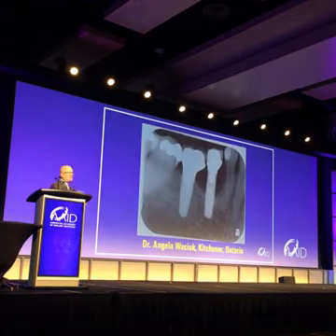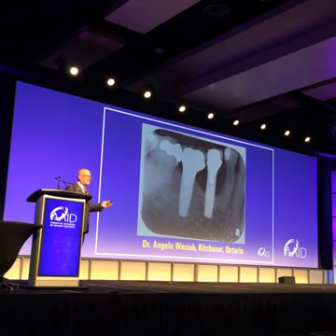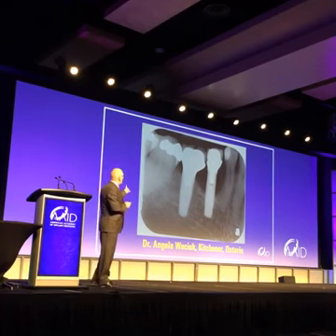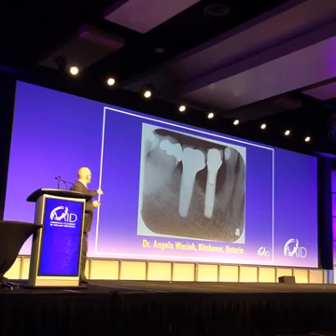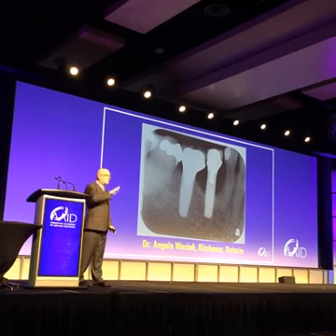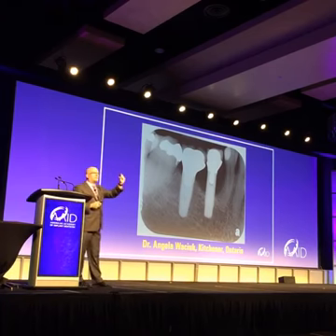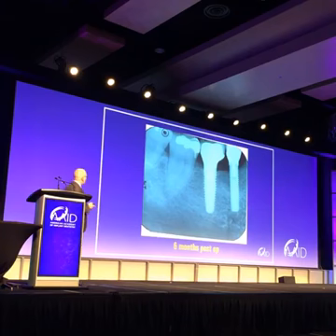This happens even in Canada. You can do this in Canada. And they're very polite. I'm Canadian, so I can say that. Anyway, there's another case. This is a case where people would open up, put the bone graft on, maybe smooth out the threads, suture it back, but you're going to have part of your implant sticking out of there. 6 months later, you can see that bone starting to come back with one treatment.